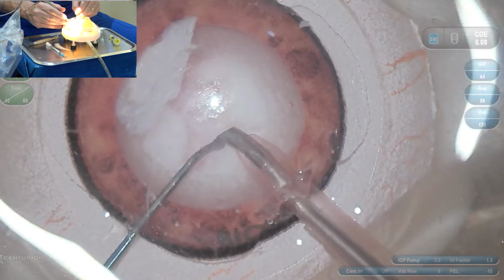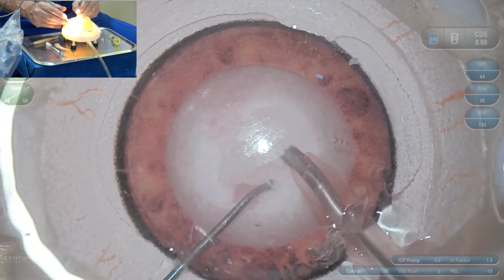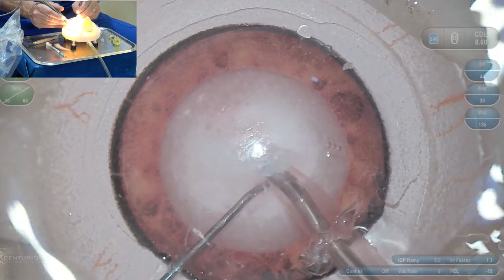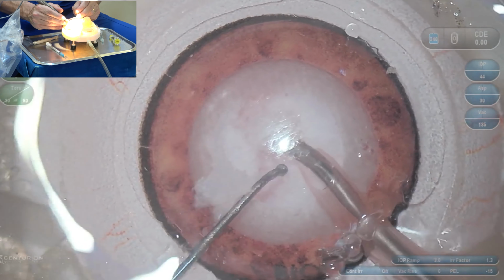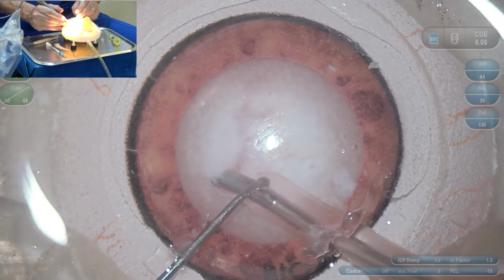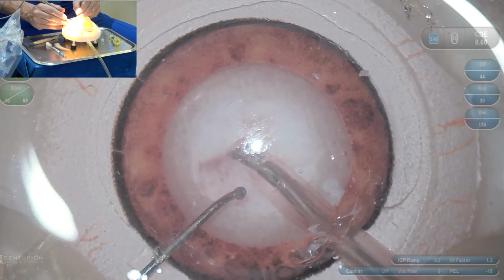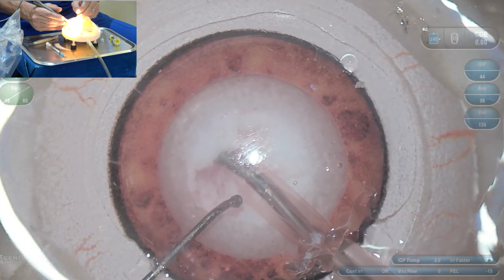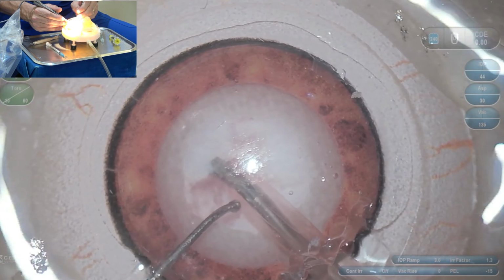You can get very superficial, like I did in the beginning. In the second attempt, I did it more perfectly, and then I did the chopping. The same thing, I have it. I need to control that fragment, and then I put my second instrument, and I do the chopping again, okay? Then I have smaller fragments. Look how efficient the ultrasound is.